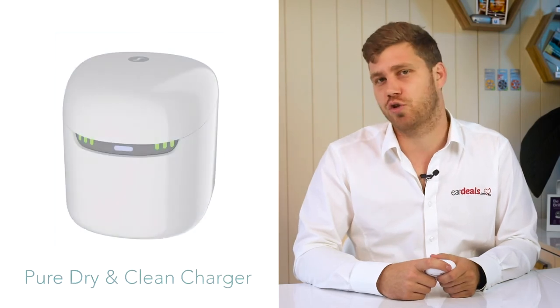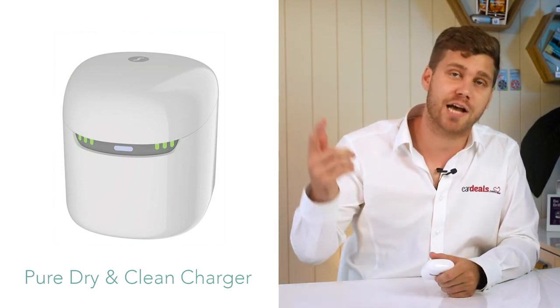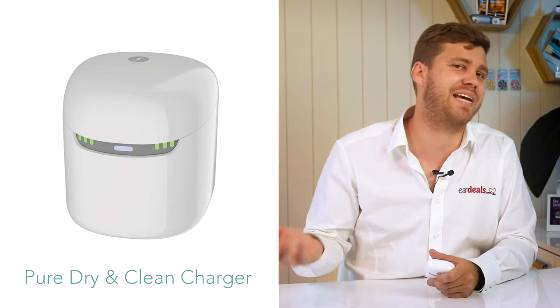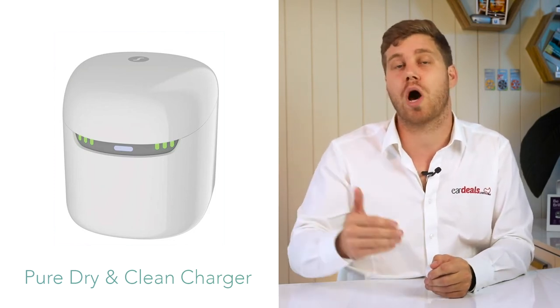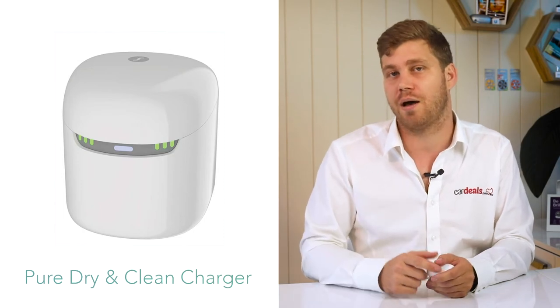The third option is the dry and clean charging case, ideal for people in humid environments such as Townsville, Cairns, Darwin, or high-rainfall areas. Since moisture is the number one killer of hearing aid technology, this charger simultaneously charges, dries, and cleans the hearing aids over a four-hour period, ultimately prolonging their life. The hearing aids themselves last up to 36 hours on a full charge with five hours of streaming, so you won't find them running out of battery during a standard day of use.